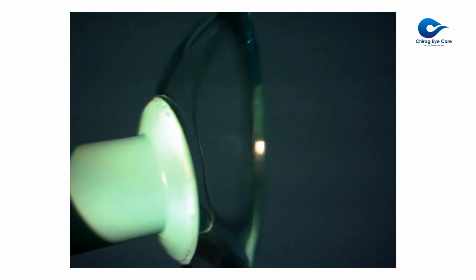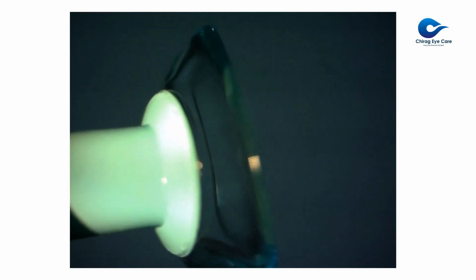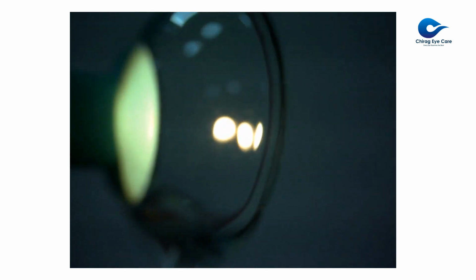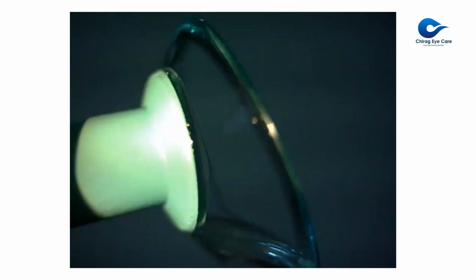It is a hard lens. So this particular lens is made up of a material known as Boston XO2. So they have excellent oxygen permeability nowadays, and it is shaped like a bowl where you fill the fluid.